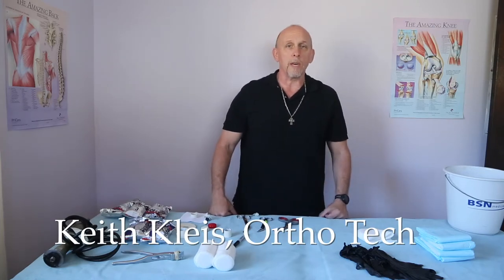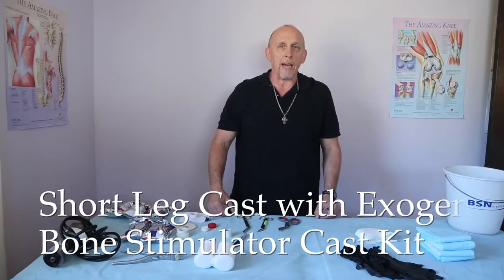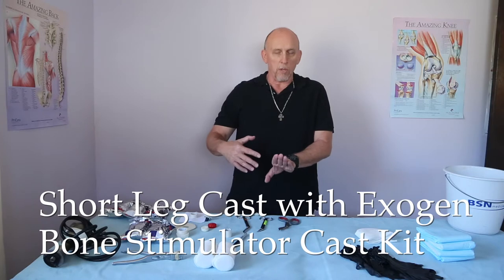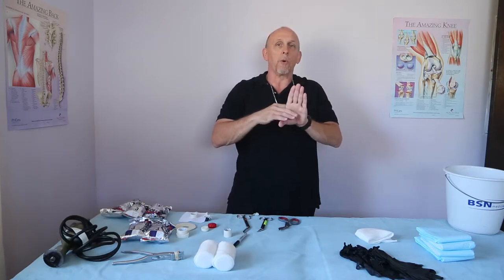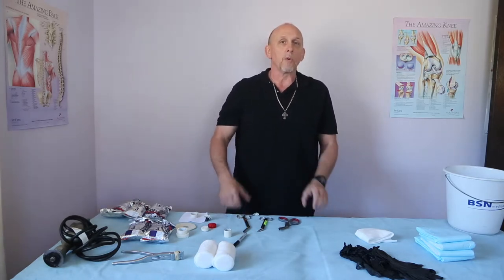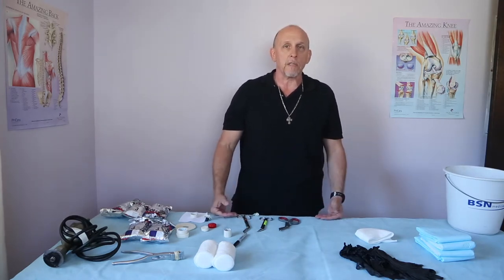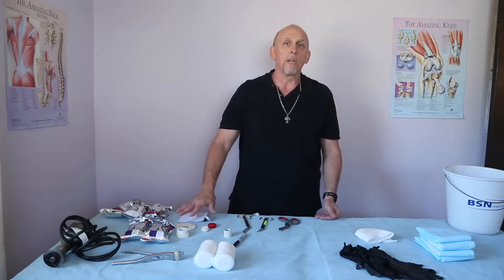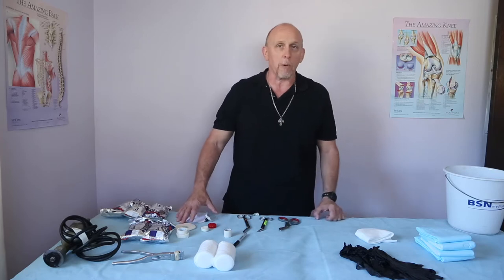Hey, Keith here. Today we're going to do a simple standard short leg cast. I know that's simple, but over the years I've seen so many casts where the technician went straight across the foot and either fell behind the great toe metatarsal or buried the little toe. So I'm going to show you a little trick I came up with to get that angle and protect the metatarsal heads without burying your toes. And because this is such a simple cast, I'm also going to incorporate the Exogen Bone Stimulator porthole, or gas cap as we call it where I work.